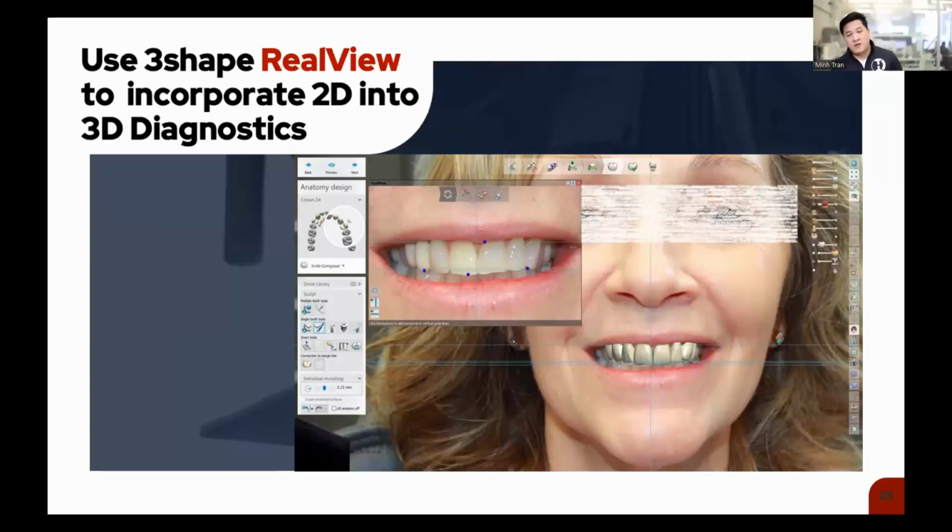And also for virtual diagnostics, I take a very multidisciplinary approach, right? So typically we try to go with a treatment nowadays that's very minimally invasive because of the tools that we have available to us. So I always try to go very conservative in terms of what my recommendation is for reduction. So a lot of times my first suggestion isn't even anything that's restorative. It's typically ortho or something like that, right?